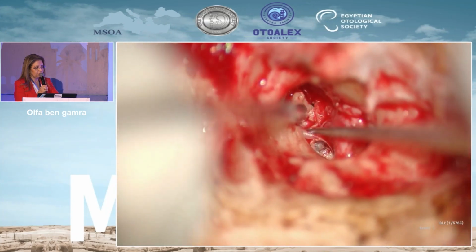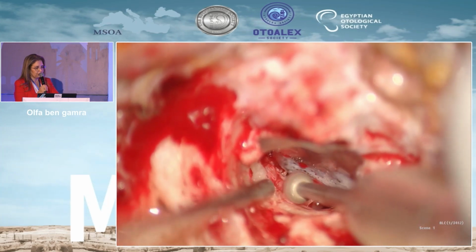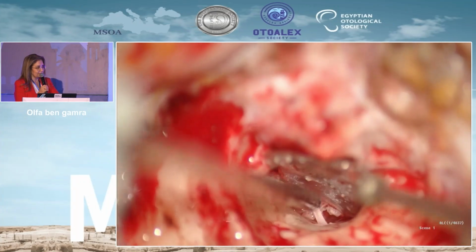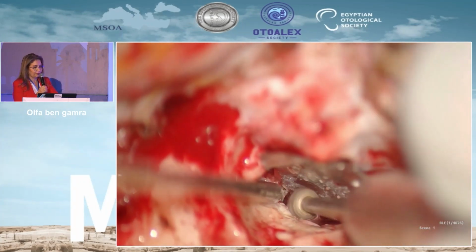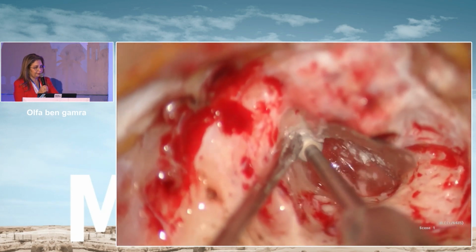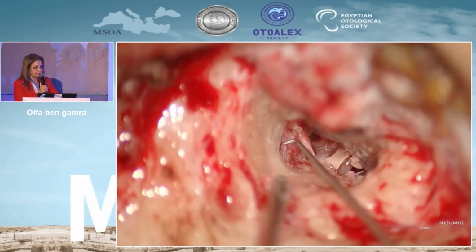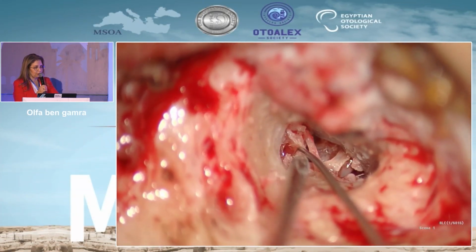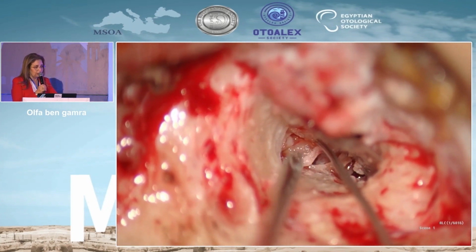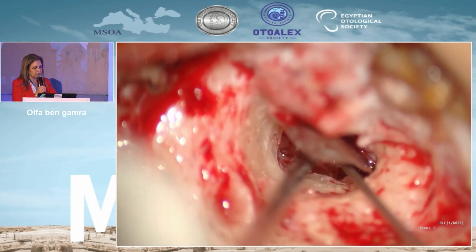We dissect the invagination, the epidermal invagination. We expose all the disease. We must remove carefully all of the disease posteriorly.